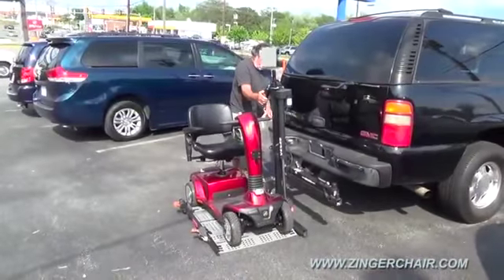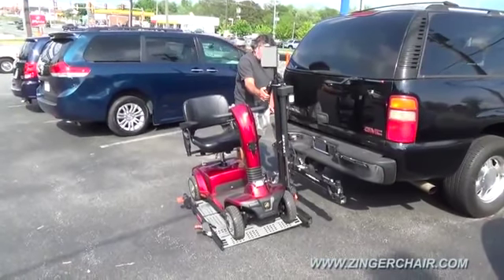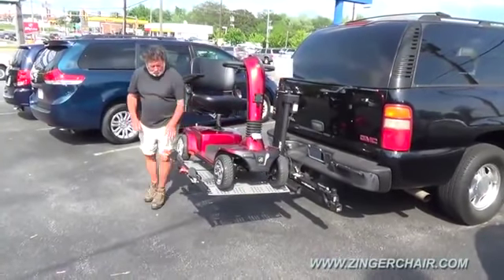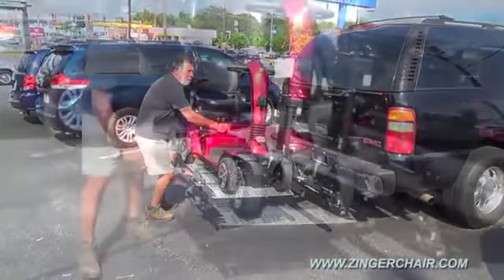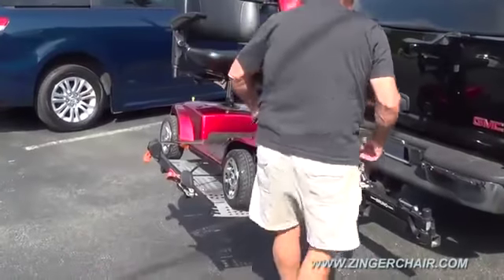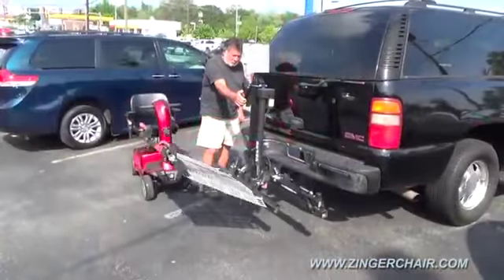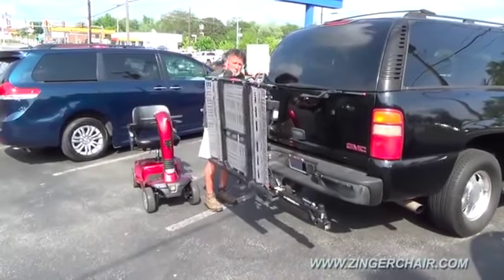Full-size scooters or power chairs don't do much that the Zinger can't do as well, but they are so heavy that they require a vehicle-mounted lift to take them along. A permanently installed rear lift like this is not only very expensive, it can make parking impossible. It blocks you from using your trunk and it exposes your scooter to rain, road grime, and scooter thieves. After unstrapping and unloading your scooter, the lift must be returned to its stowed position — that's a lot of time holding a button down.